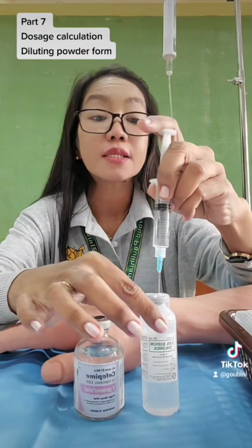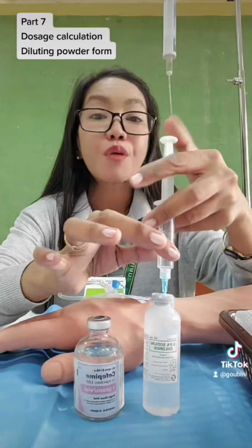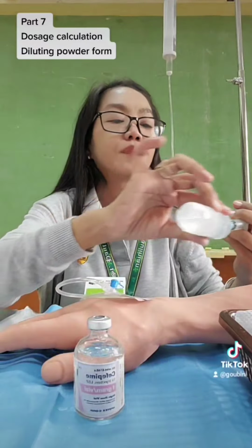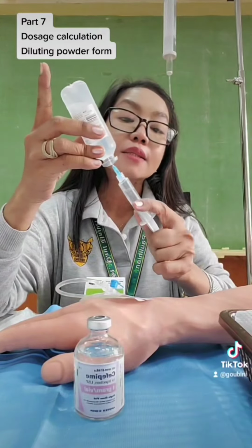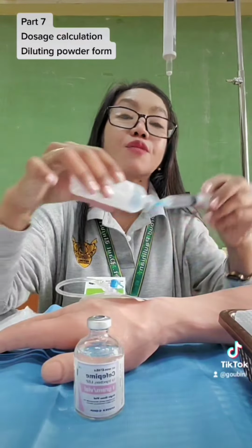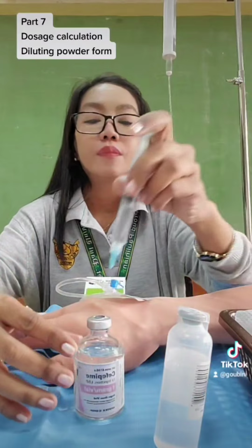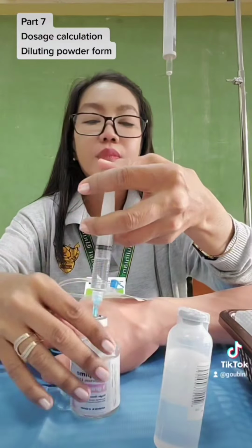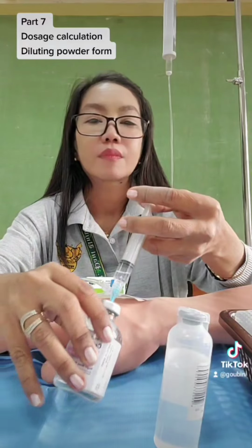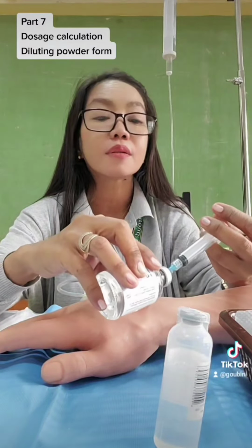If you have a 10 cc, that is the preferred syringe. Then you will aspirate 10 cc of NSS. Alright, you aspirate.